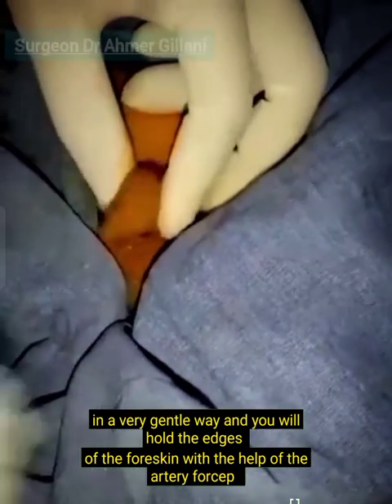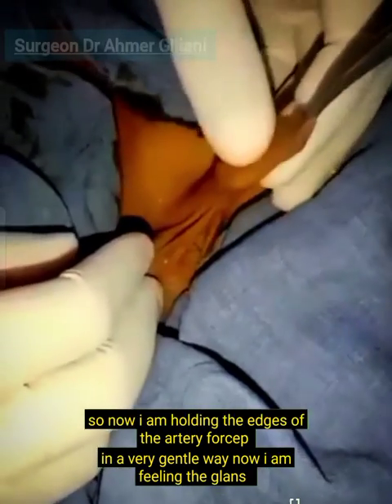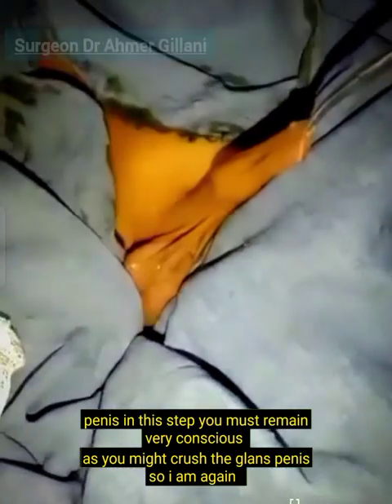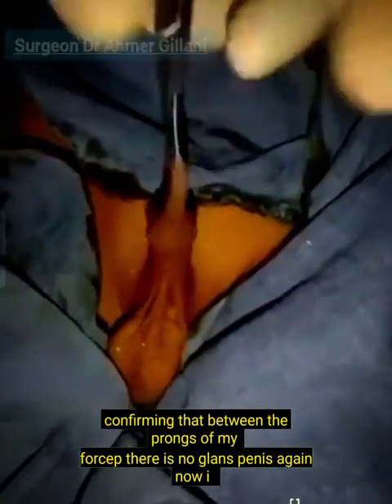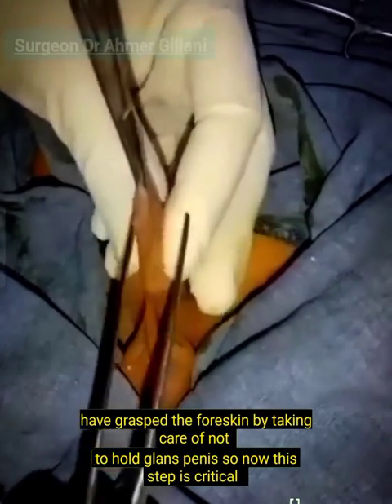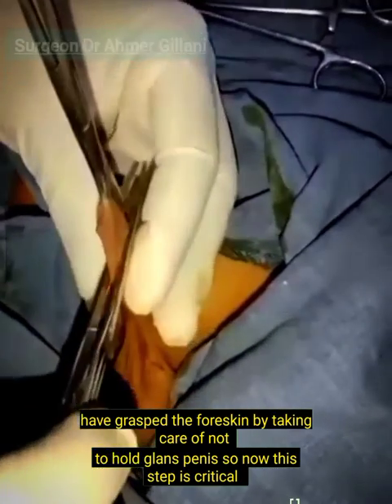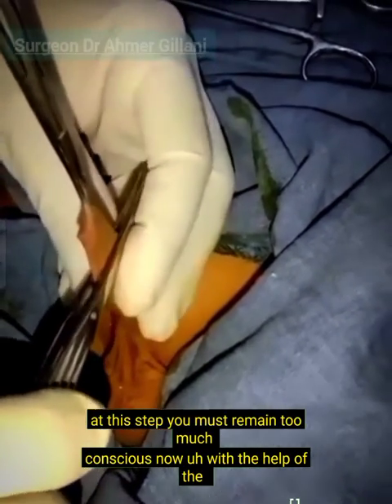Hold the edges of the foreskin with the artery forcep gently. At this step you must remain very conscious, as you might crush the glans penis. I am confirming that between the prongs of my forcep there is no glans penis. I have grasped the foreskin taking care not to hold the glans penis — this step is critical.